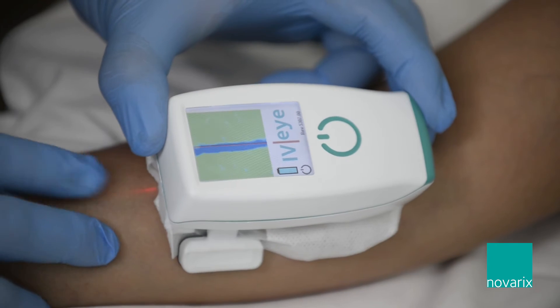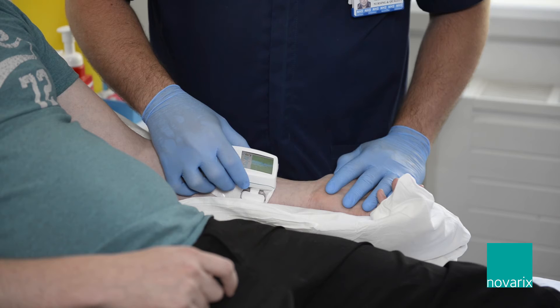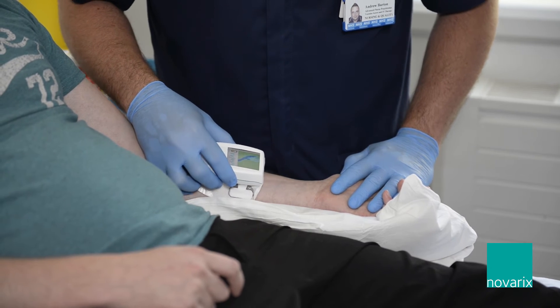Our patients that we use the IVI on are chemotherapy patients, which means they have very poor veins, so cannulation is very problematic. Chemotherapy damages the veins, which makes them harder to palpate, which is why we use the IVI to be able to locate the veins.